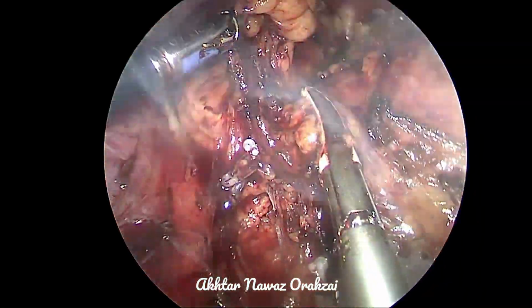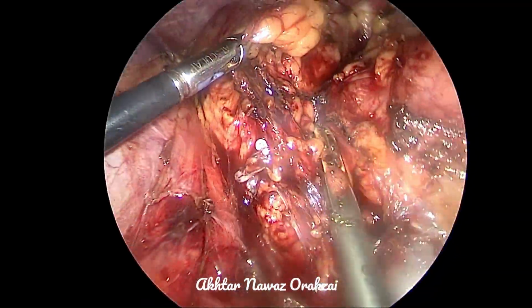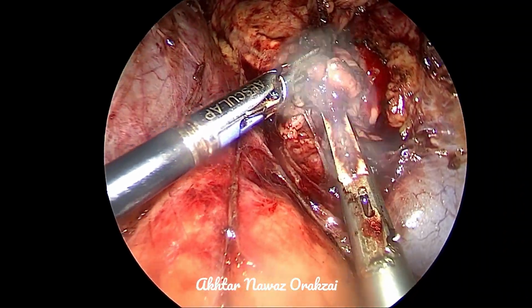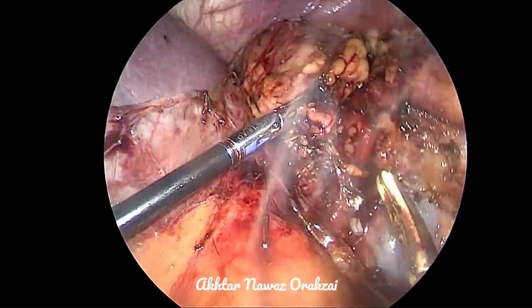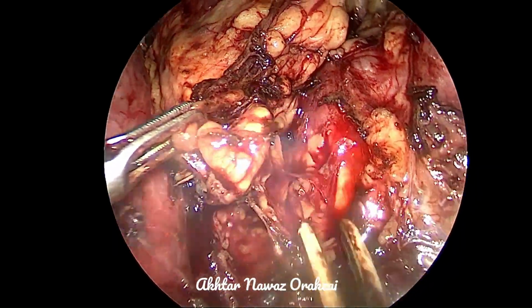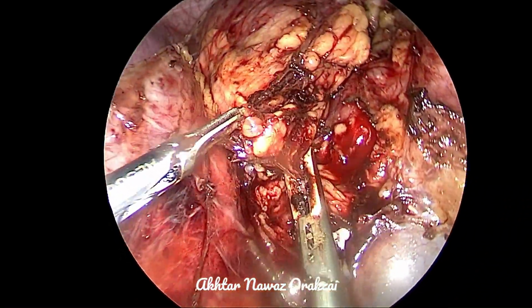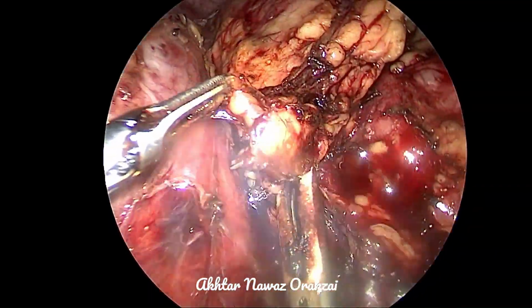It's a small artery, will not be very lethal. However, if we injure that, then the clipping may compromise the upper pole. That's why here we are dissecting very carefully, looking for pulsations. You can see the pulsation at the tip of our ligature. So that is this. Yes, this is the branch of the renal artery to the upper pole. So we are going slowly and gradually. Small bits are taken, and we do not take anything unless and until we are 100% sure that there is no small artery in it.